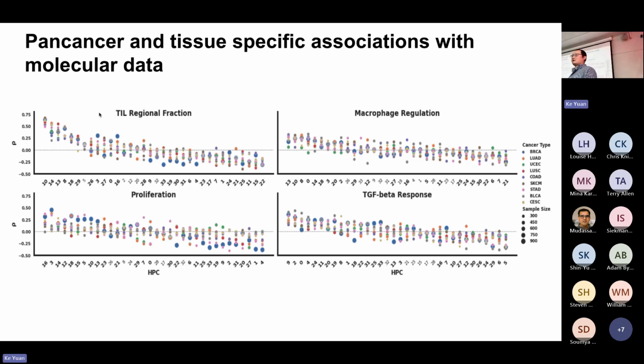we defined our clusters across cancer types. And so you can imagine a cluster defined by slices from quite diverse cancer types. And when we do this, our collaborators were a bit puzzled, because it's not a very common thing for them to do, to look at histology across organs. But nevertheless, we find interesting associations that are quite strong across cancer types.